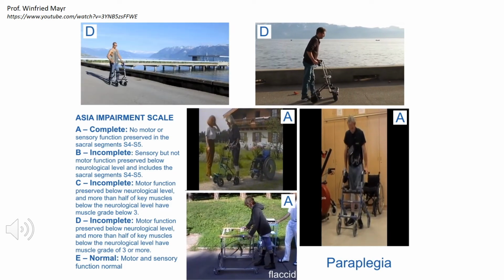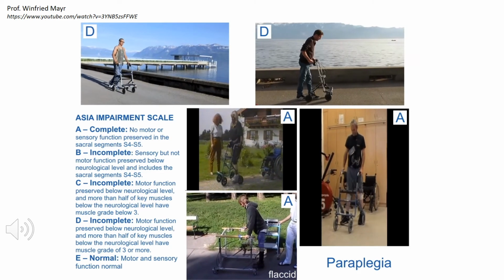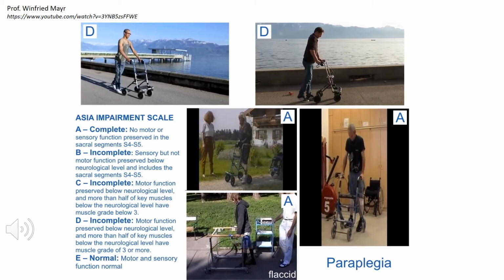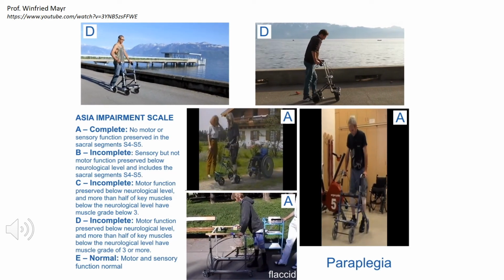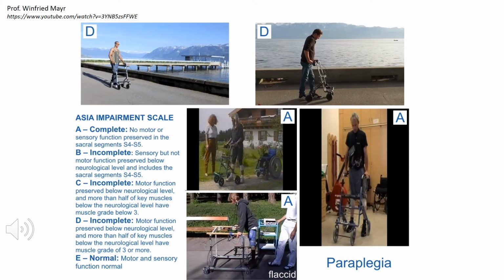But overall, in our cases we have a very nice therapeutic walk. It has high value to verticalize people, to keep the neuromuscular system activated, and I think this is per se already a very big value. But it is not a restoration of gait like it is often promised.